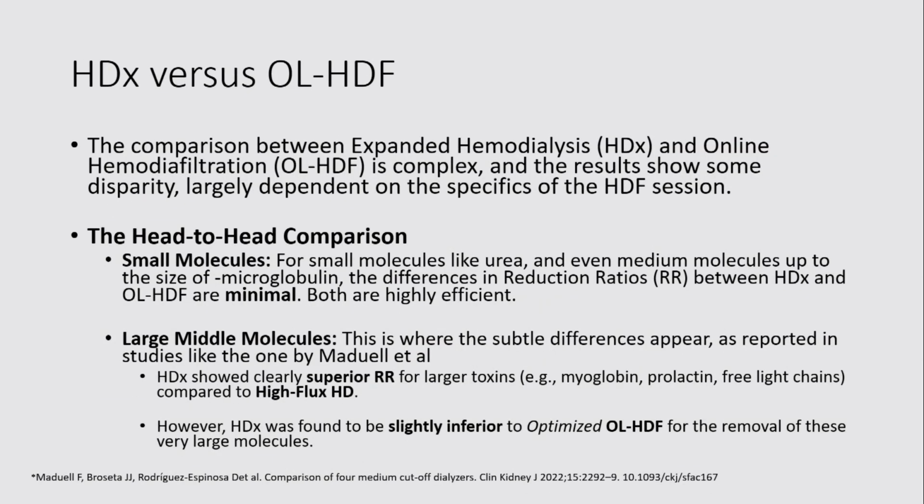Coming to the comparison between expanded hemodialysis and what we have currently, online hemodiafiltration. It is a complex comparison, and there are some disparities, and this largely depends on specifics of the sessions and specifics of the goals which are achieved with each of these therapies. For small molecules, both are highly efficient, there is no difference.